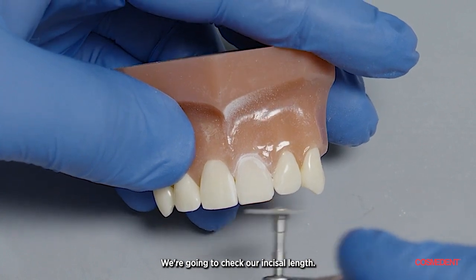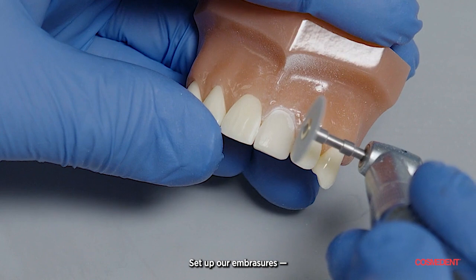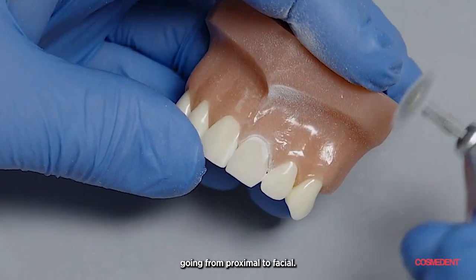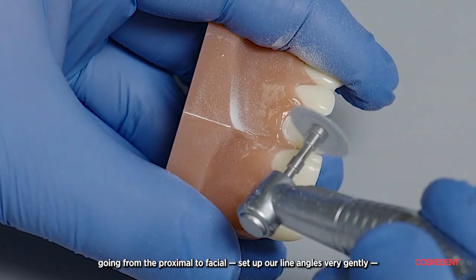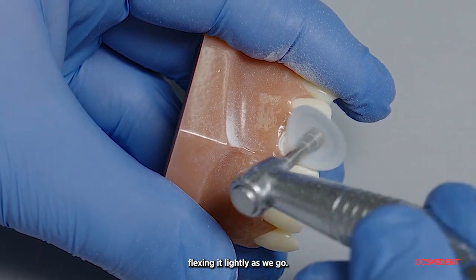We're going to check our incisal length, set up our embrasures, going from proximal to facial. Same here — proximal to facial, setting up our line angles very gently, flexing it lightly as we go.